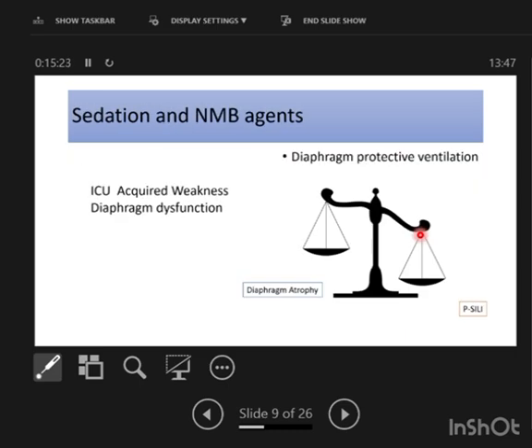What about sedation? We have a very excellent lecture on sedation and neuromuscular blocking agents. In our unit, we have made a policy of using Dexmed. It's a wonderful drug, less delirium, and the patient is consciously sedated, and no police will come to tie your hands here. That was an excellent video actually. So you have to balance here. Now, if I need to ventilate a septic shock patient for the first 24 hours, I don't want him to trigger and cause more hemodynamic problems.